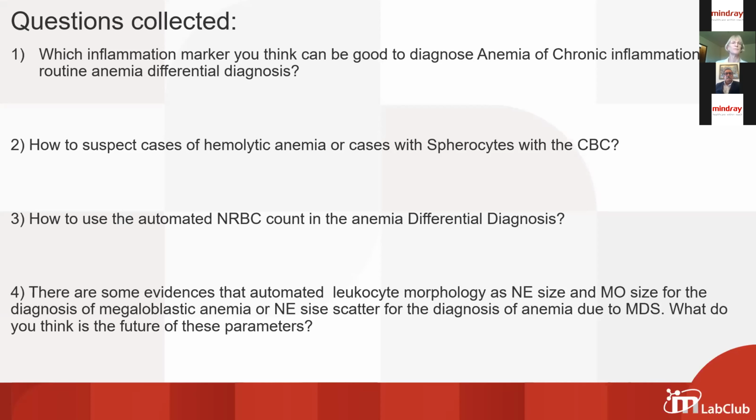As people in the clinical laboratory know, the MCHC can vary a lot and somewhat depends on whether there's any mild degree of hemolysis in the blood sample. So I don't think it's a very reliable test. I would say if there is anemia, you look at the blood smear. The critical thing about spherocytes, again, is having a good smear.